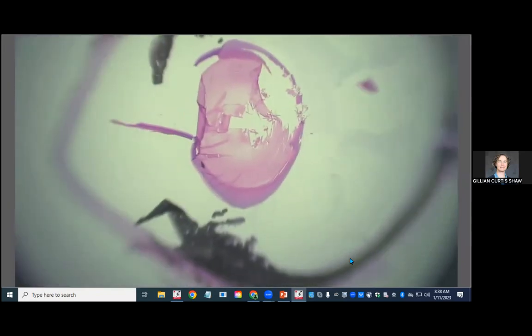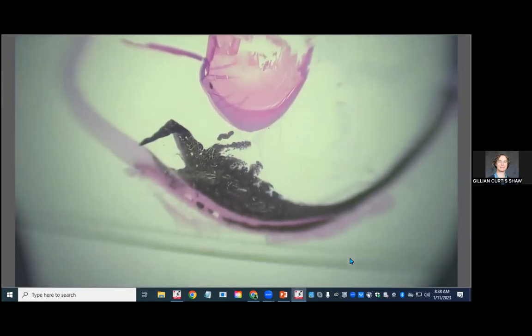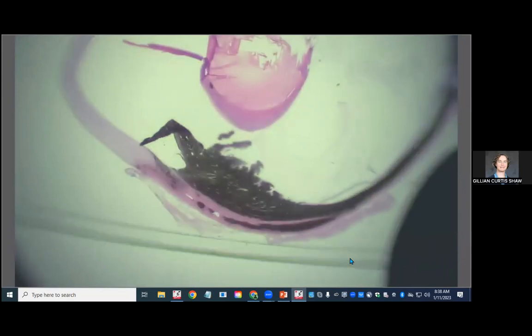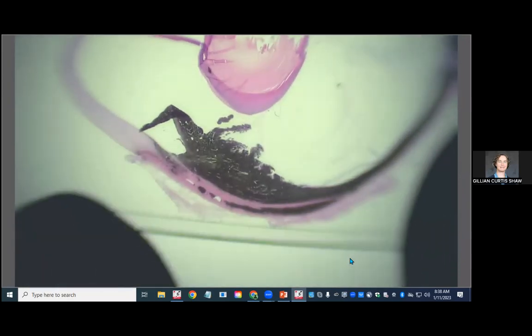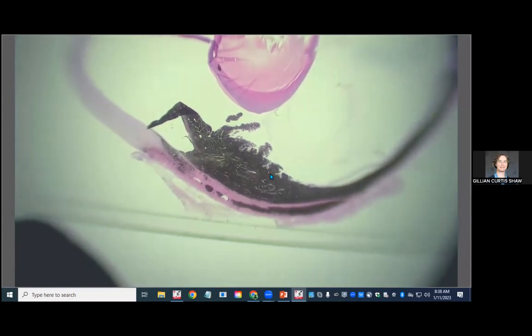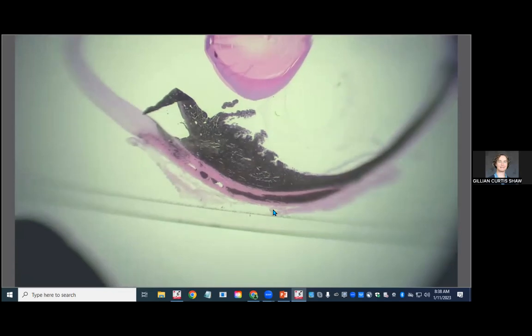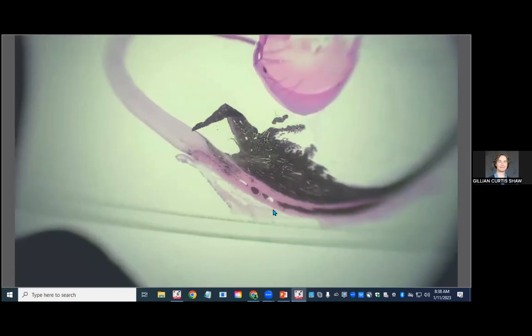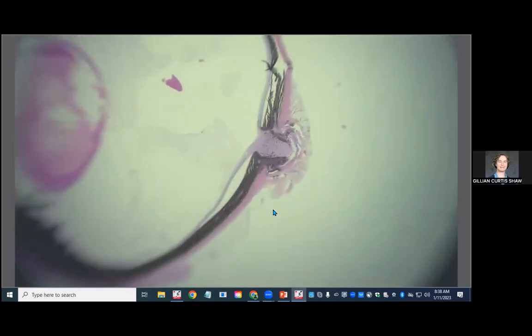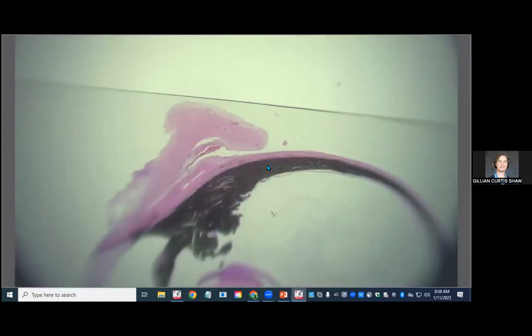I feel like we could get almost all of the important diagnoses from the gross photo, but not surprisingly, the subgross looks pretty similar to what you might imagine from the gross photo. So the iris and ciliary body are thick and very brown, and there's also a lot of pigment there in the sclera as well. I think here it's actually tracking along the veins of the scleral venous plexus. And as we follow around, that choroid is just way too thick and way too brown. So that's abnormal. And as we follow it around, similar story on the other side.